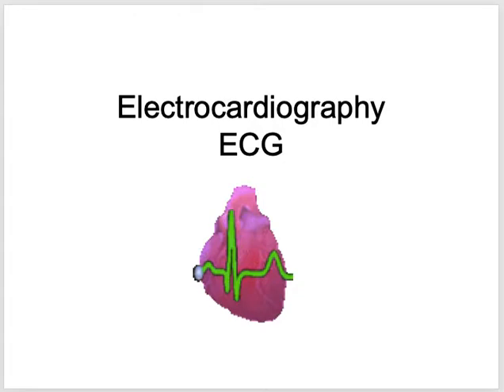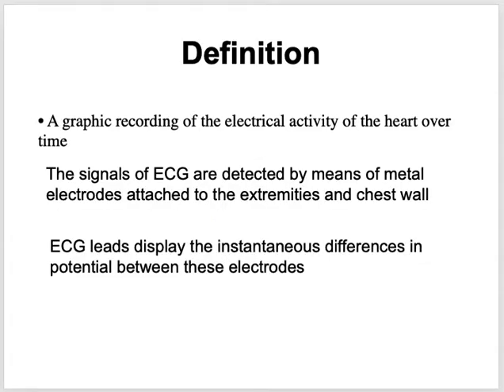So to start with electrocardiography, ECG, which is also called EKG. Americans call it EKG. So ECG is simply electrocardiography or electrocardiogram. It is one of the most important, commonly requested tests in medical practice. By definition, it's a graphic recording of the electrical activity of the heart over time.